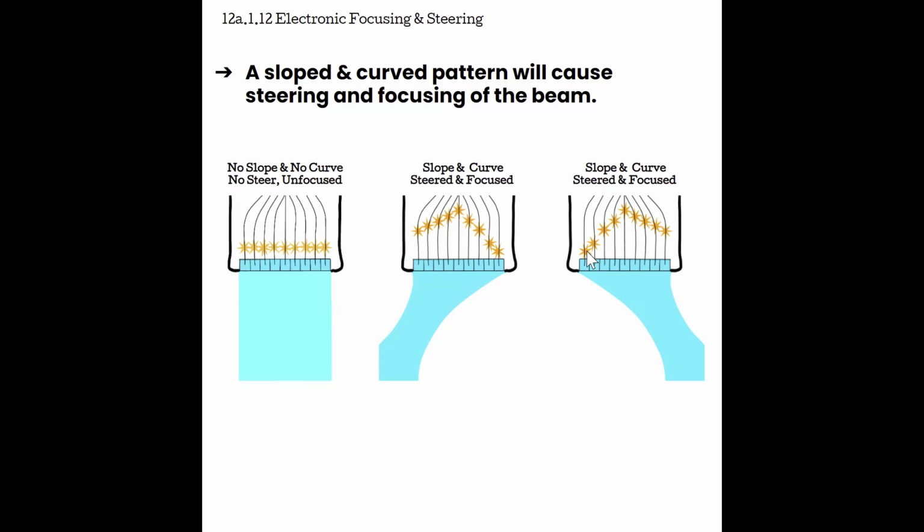Compare that to the other side then. Again, we have a curve in place, so we know it's going to be focused.